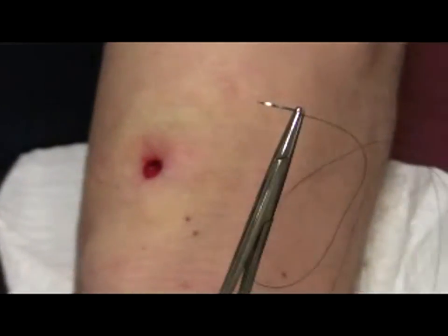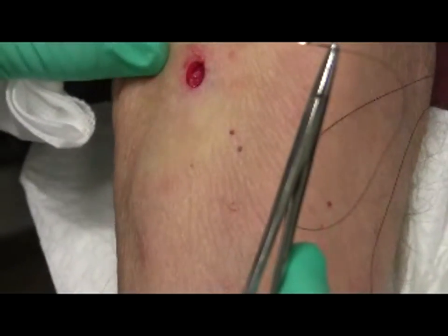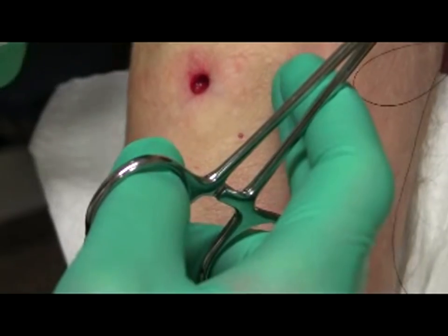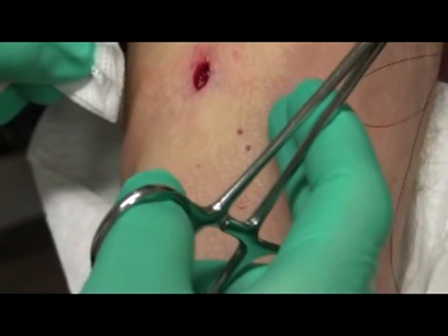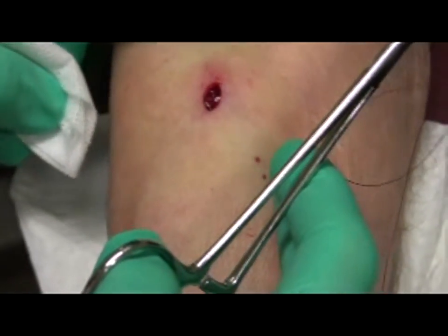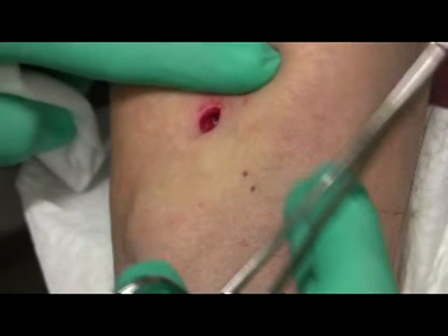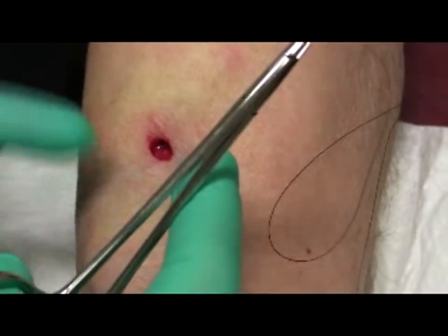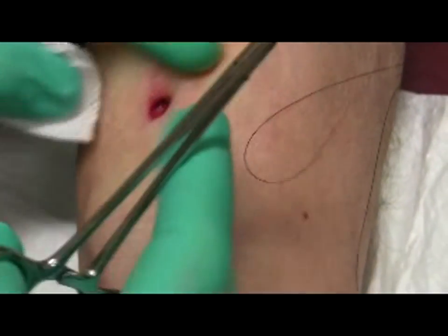Frequent blotting of blood is key to facilitate requisite visualization of the area to be sutured. If hemostasis is an issue at the onset, there is often an area around the biopsy site that you can continuously press to stop the bleeding — around the feeder vessel. It's not bleeding at all here, so this section is kind of irrelevant.